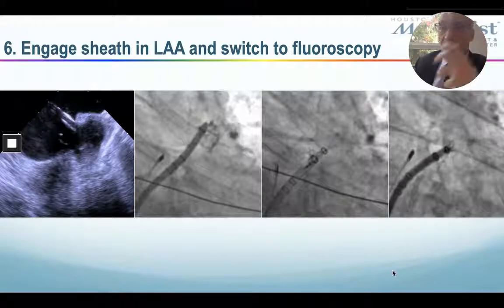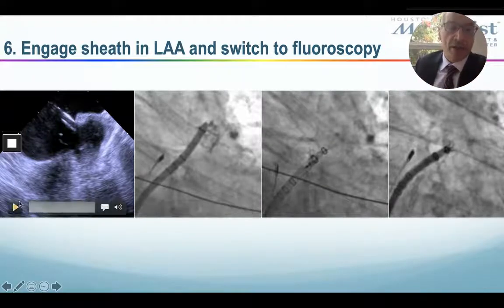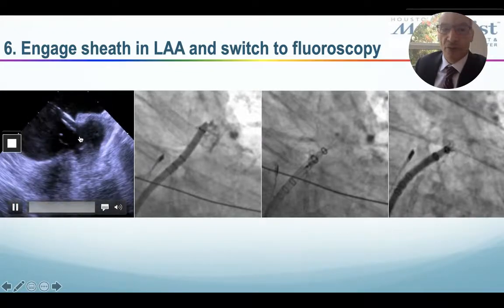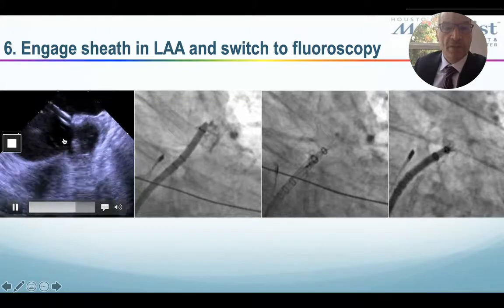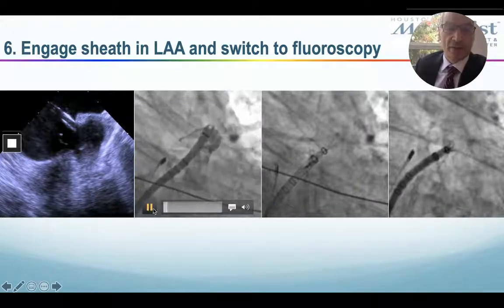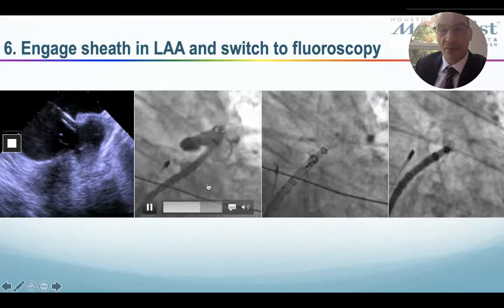So we've seen it, we've taken measurements. We then engage the sheath into the appendage. We first advance the pigtail, and you can do this with ICE guidance only. Pigtail into the appendage, then you advance the sheath over the pigtail and take your injections, your angiograms.